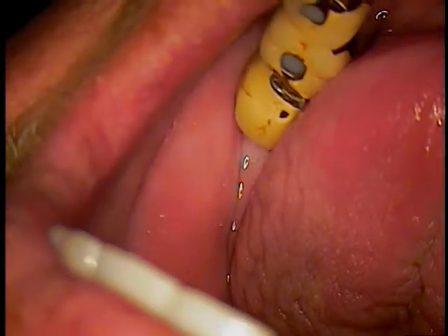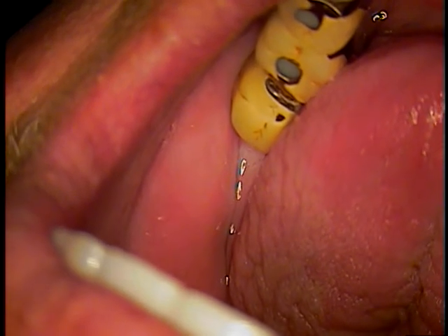Now let's get something back in there. I'm going to need Viscostat, please. This has got to go in the baggie and in a cleaner. Okay, I'll let you do this next so we can get the part back. Open that one up, please. Yes, clean them both. No, I want them both. Don't keep them separate, put them in there the same.